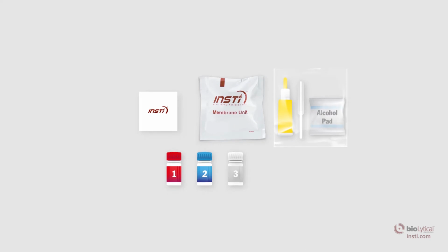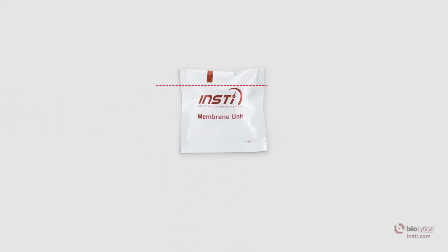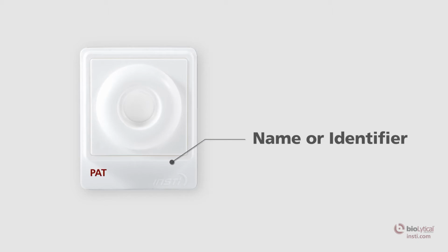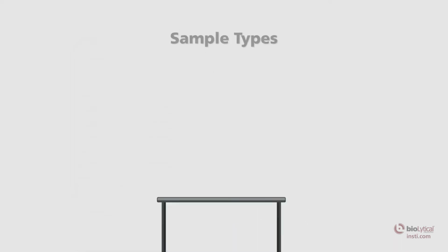Open the INSTI package and remove all contents from the pouch. Tear open the membrane unit pouch at the pre-cut edge and carefully remove the membrane unit without touching the center well. Place the membrane unit on a level surface. Make sure the tab of the membrane unit is oriented towards you. For sample identification purposes, the tab may be labeled with the patient's name or identifier. Use of the workstation is optional. If the workstation is not used, place the test unit on a flat surface.